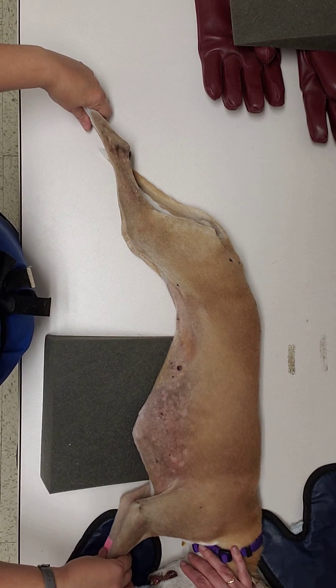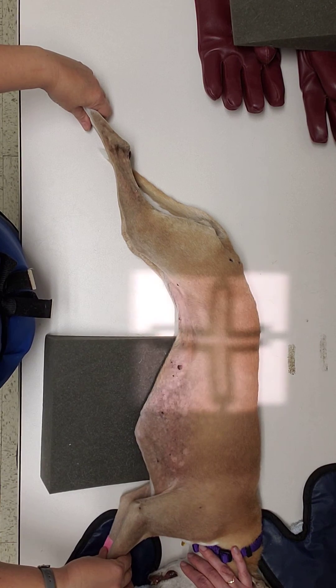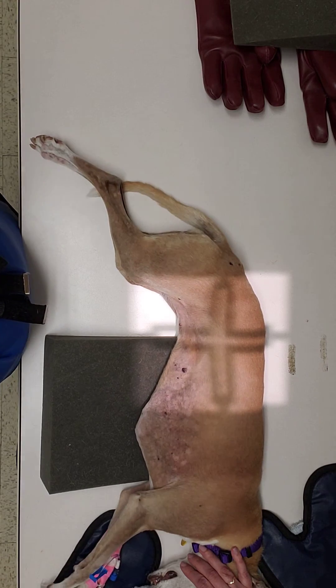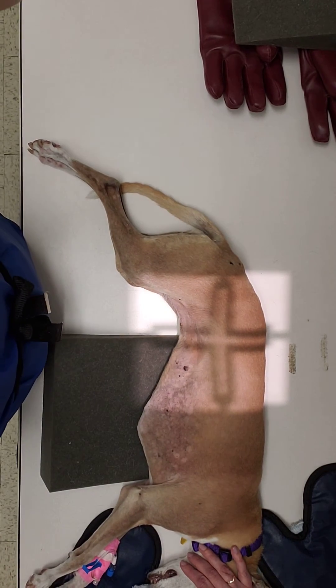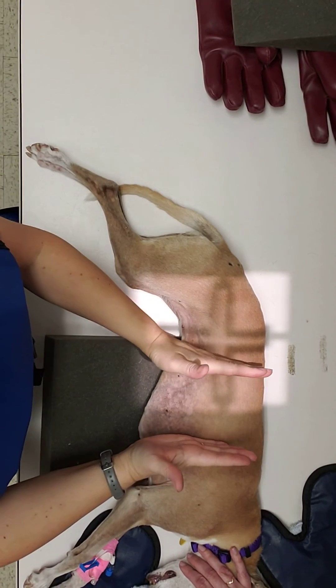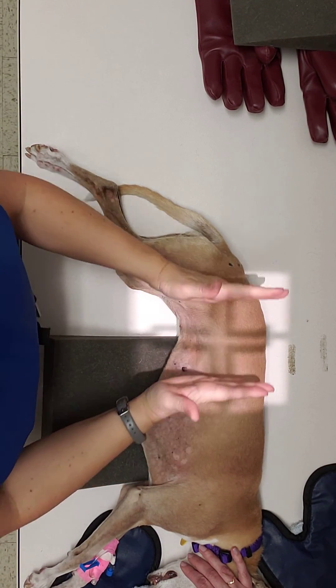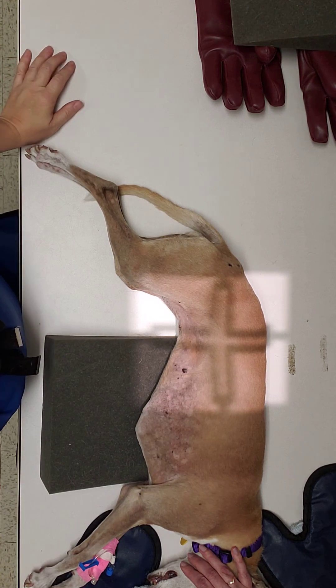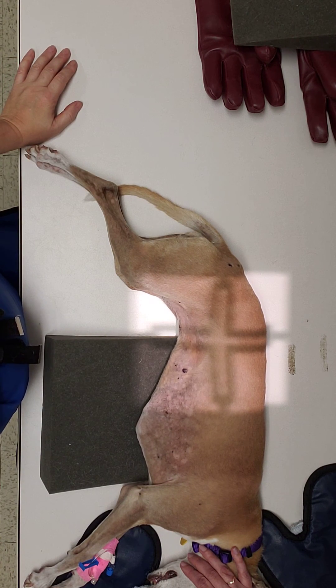One of the things you want to keep in mind is she's actually small enough to fit on this radiograph. If she was a larger dog, you would possibly have to take the cranial aspect of her abdomen and then her caudal aspect of her abdomen separately. And that would be what you need to do for positioning and collimation of your lateral abdomen.